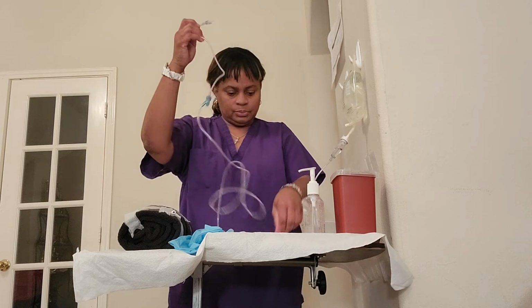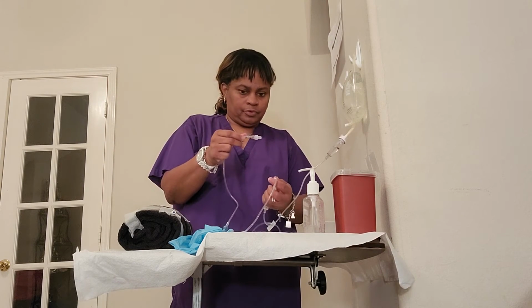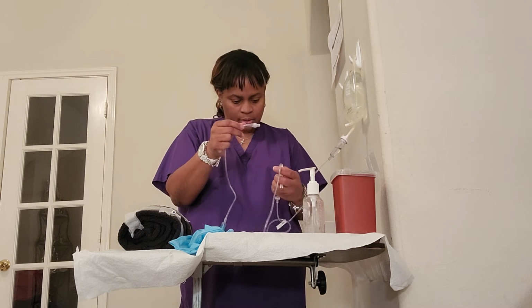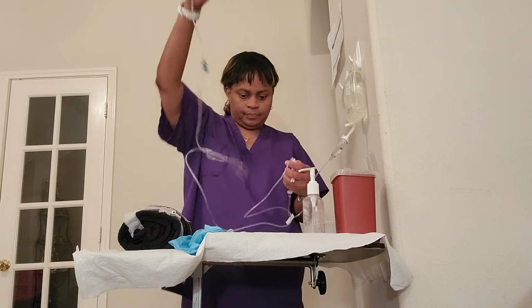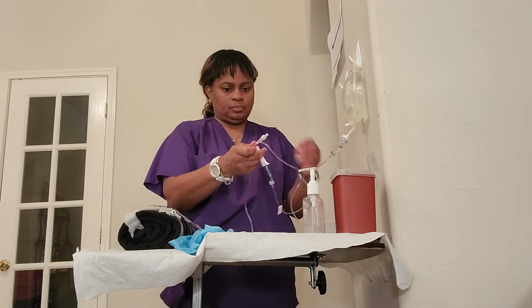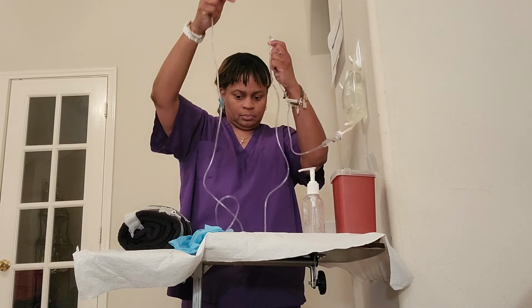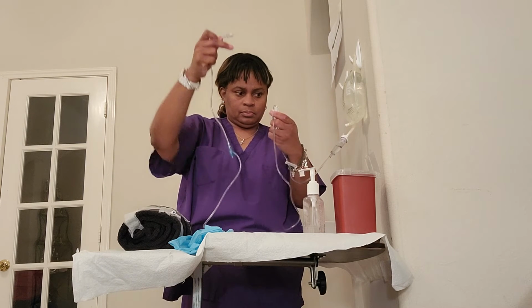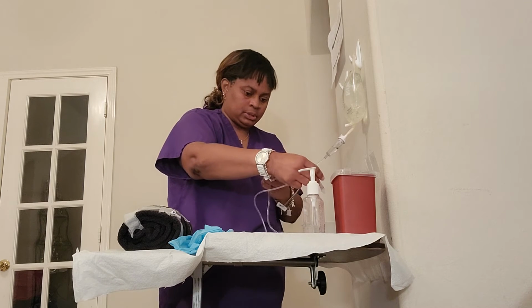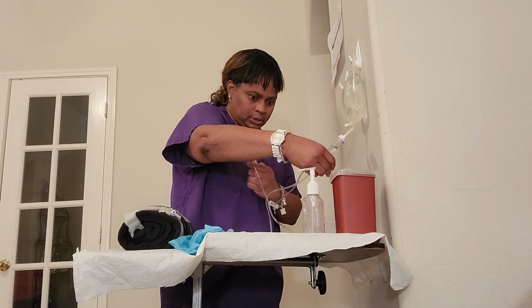Now I'm going to release the roller clamp so we can get some fluid in our tubing. I have a receptacle here to catch any that may overflow. But so far we're doing really good.